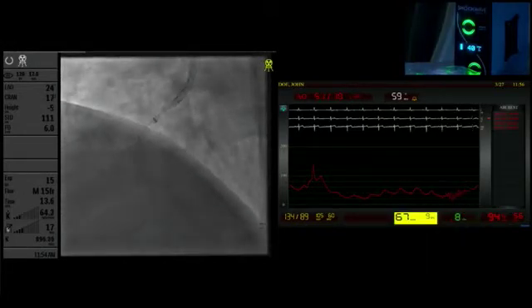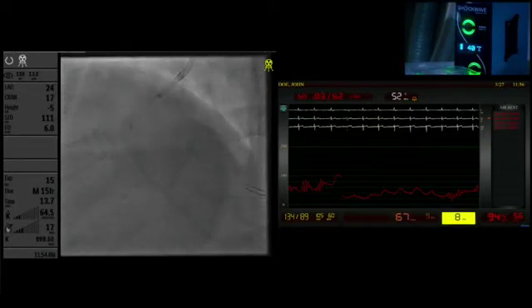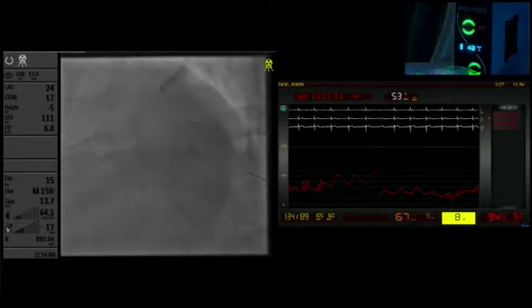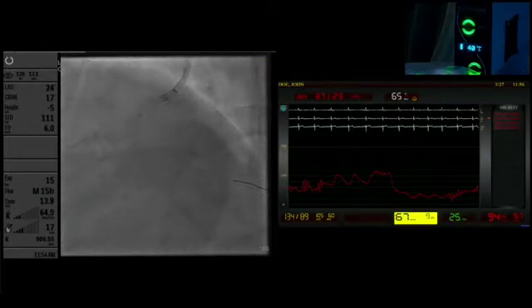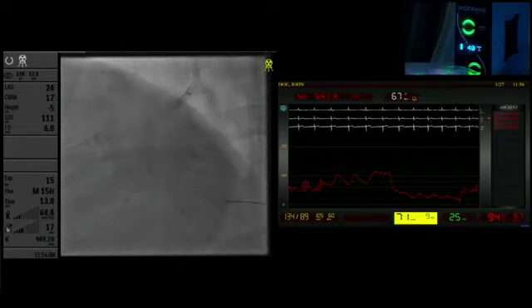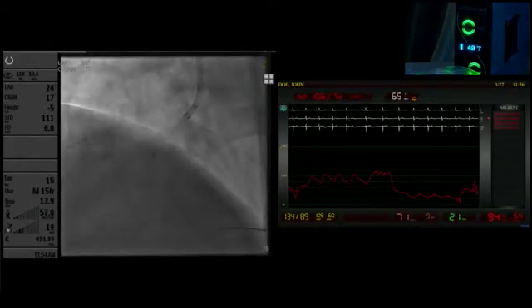Jonathan, don't you think giving it as long as you can is best? Well, you're only applying the shock waves for that 10 seconds whilst your finger's on the button. The other 6 atmospheres, there's no shock waves being delivered then. And in the study, you did go to 4 atmospheres, then went to 6 once you were done with the shock. It doesn't make sense once you're done with the shock, yeah.